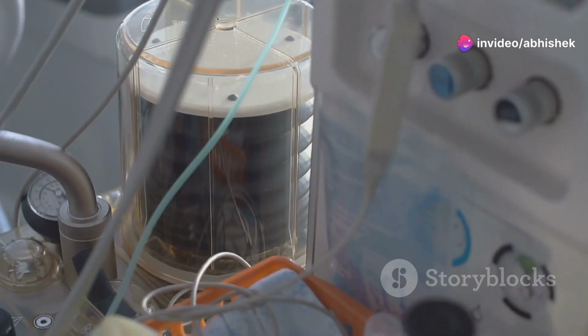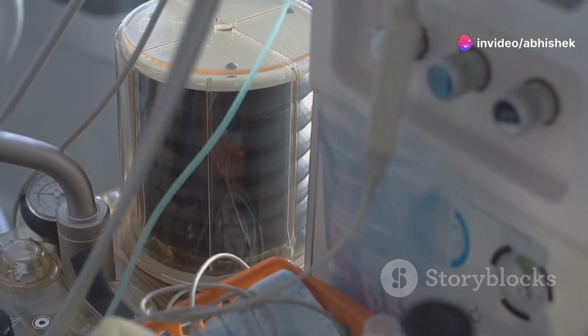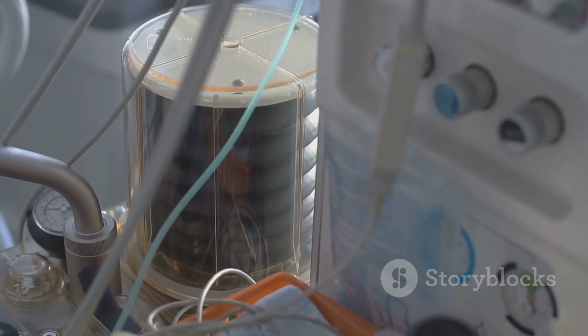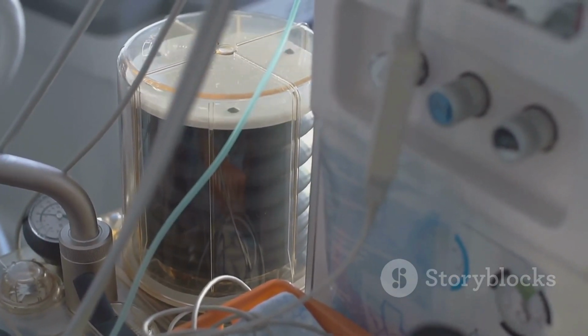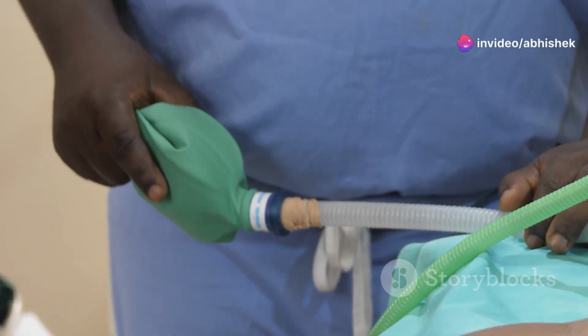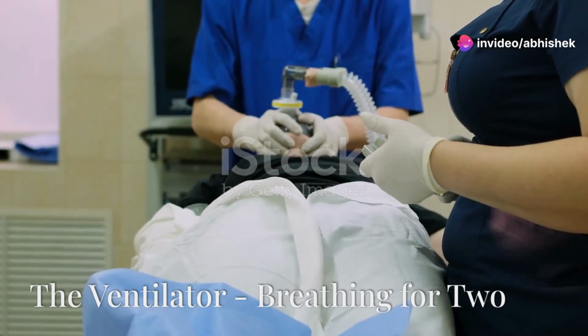The breathing circuit also contains a reservoir bag, which holds the anesthetic gases, and a series of valves that control the direction of gas flow. It's a finely tuned system designed to mimic the body's natural breathing process.